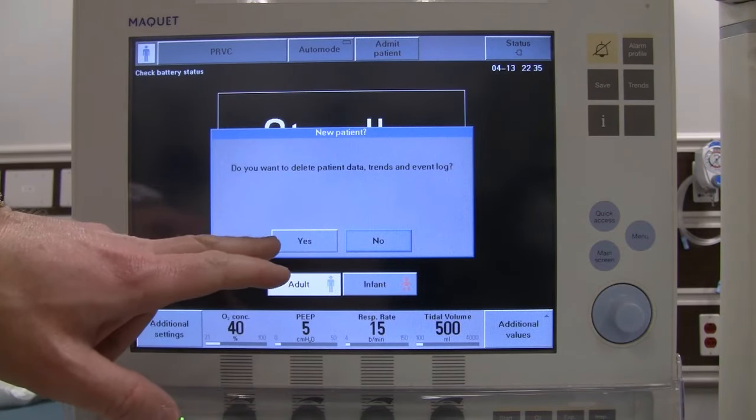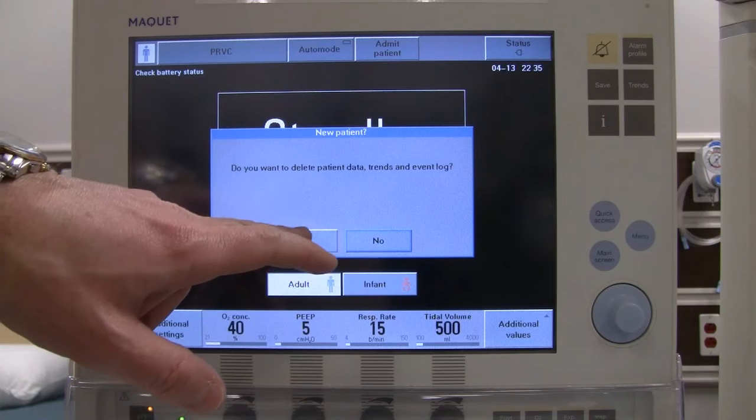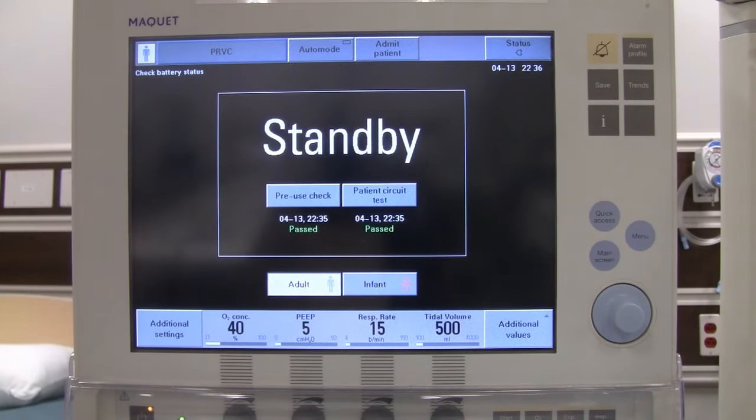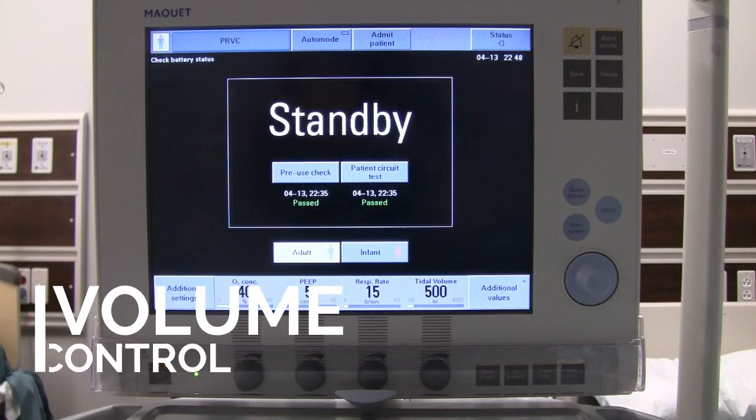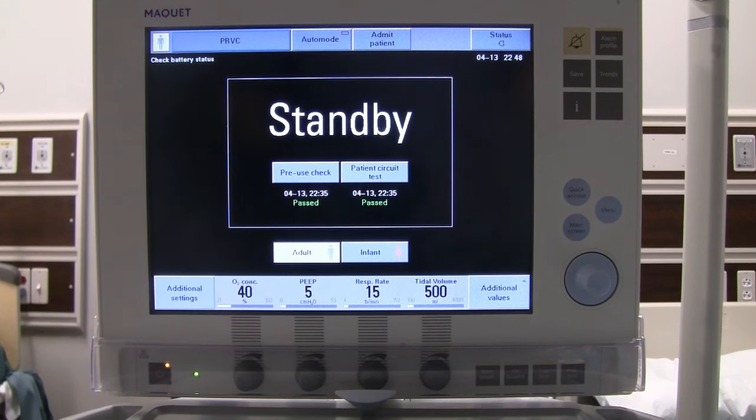It will ask if you want to delete patient data — say yes to start fresh with a new patient. It then automatically goes into standby. Now that we've completed the pre-use check, we're going to move on to putting in some initial settings.